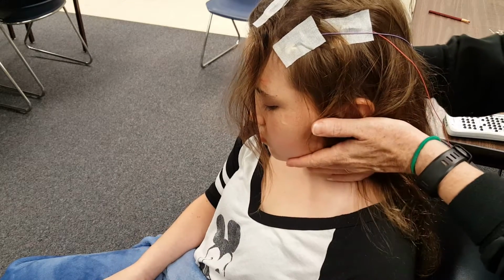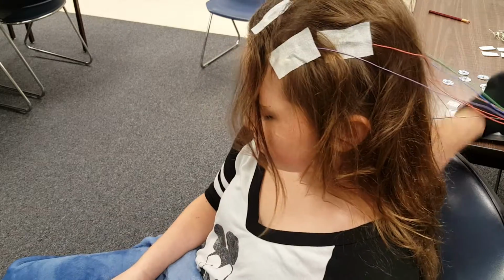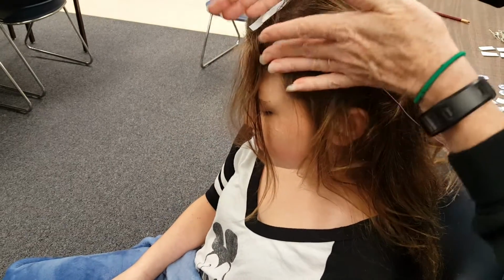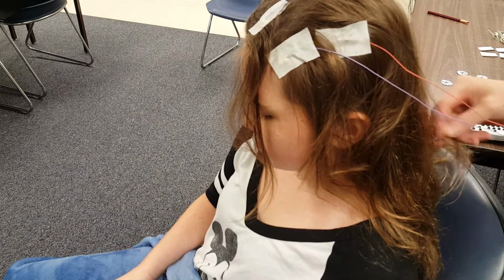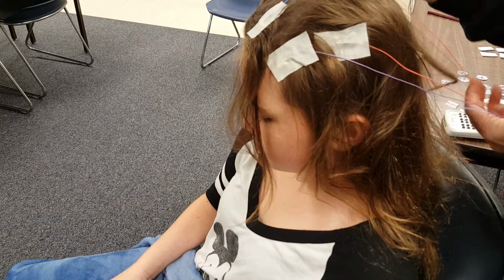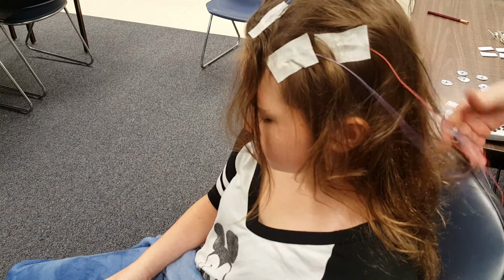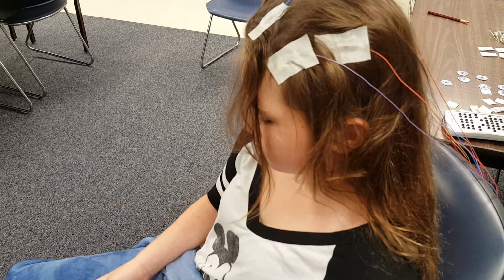Now notice how I have arranged the wires coming off of each of the electrodes. Tilt your head. I have them all facing towards the back of her head. This wire comes straight to the back, this comes straight to the back, every single one of my wires is arranged so the wire of the electrode comes off the back of the head. This is important when we bundle our wires later in the process.